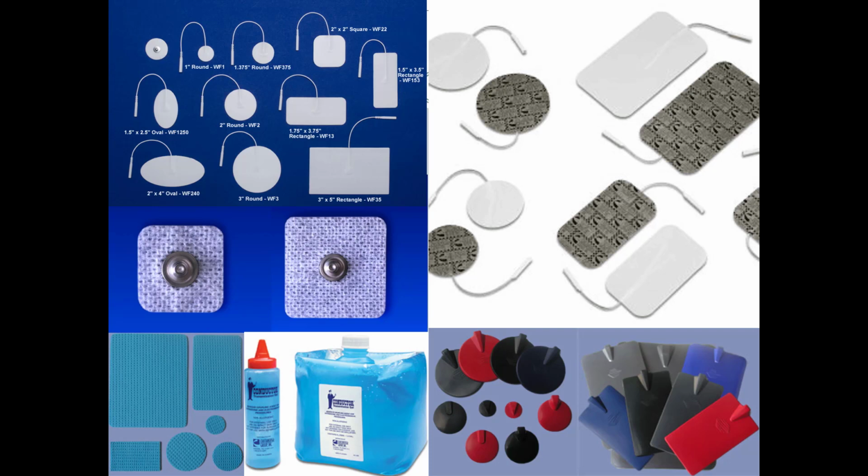The one issue with reusable electrodes is that we have to consider the potential for cross-contamination. Self-adhesive electrodes should be reused only on the same patient. If used on different patients, bacteria from one patient may be transferred to the next patient through the use of these pads.